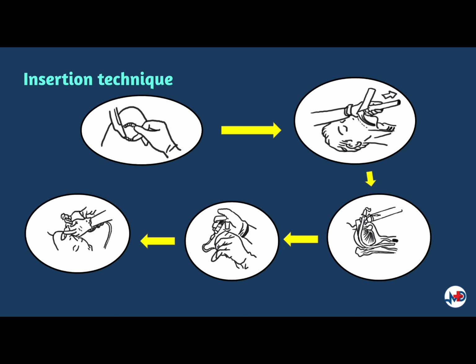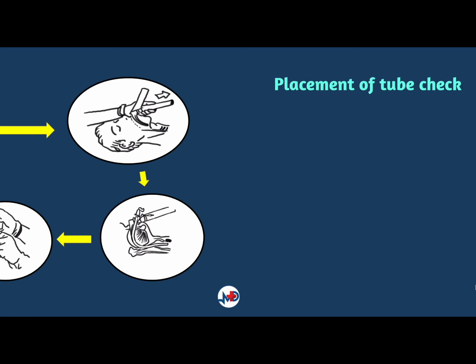If it takes more than 30 seconds for this process, remove all equipment and ventilate the patient with a bag valve mask device until ready to retry intubation.